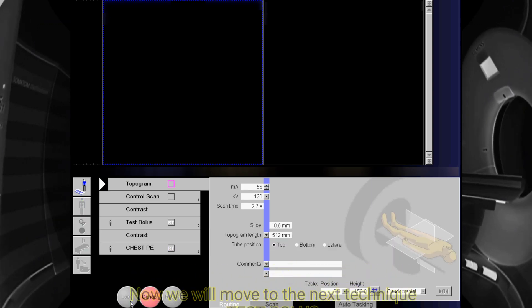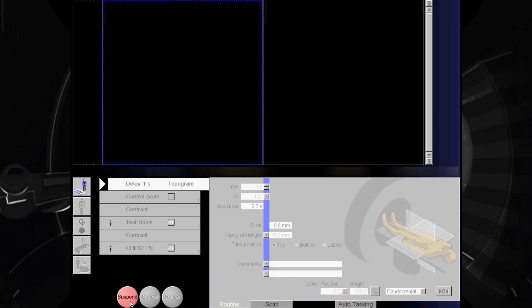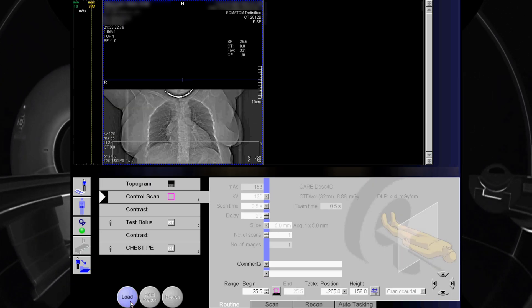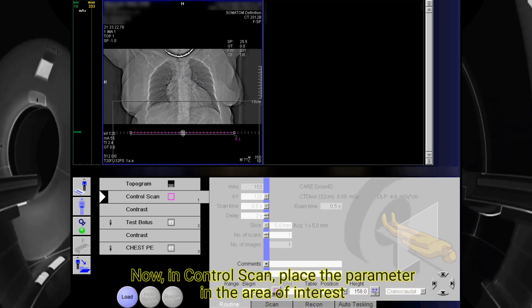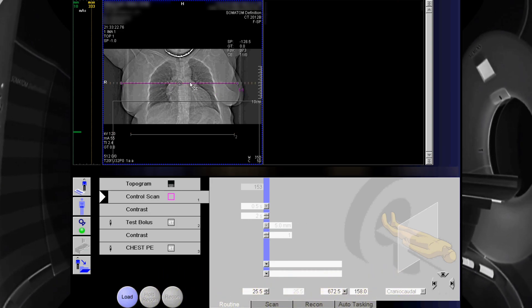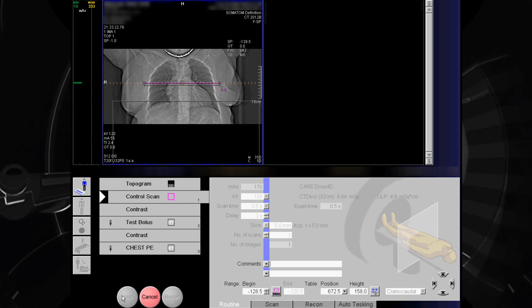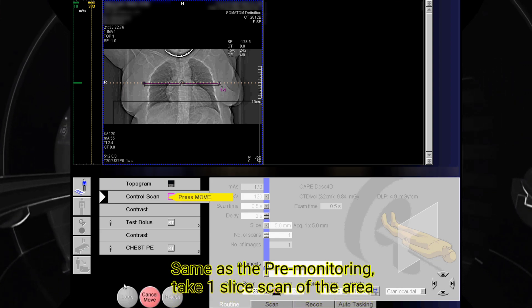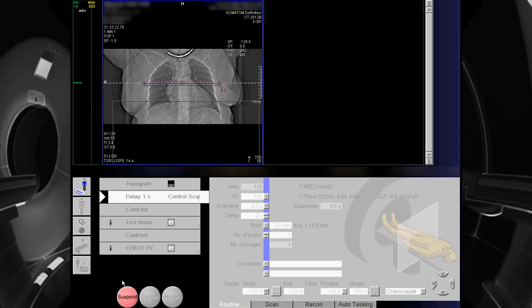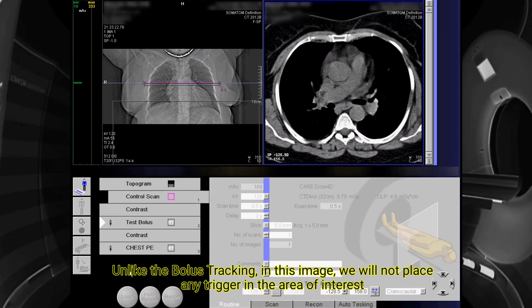Now we will move to the next technique: test bolus. First, take the topogram. Now in the control scan, place the parameters in the area of interest. Same as the pre-monitoring, take one slice scan of the area. Unlike bolus tracking, in this image we will not place any trigger in the area of interest.